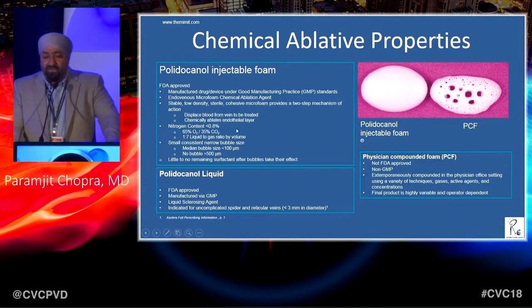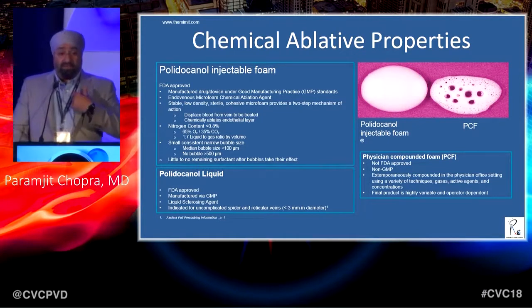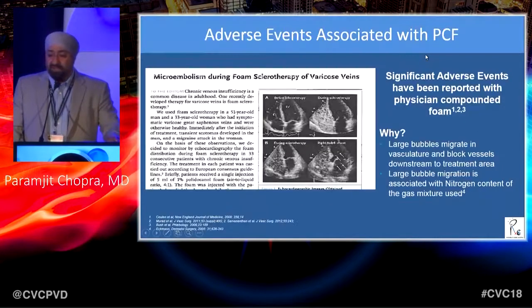You already have seen some of this and heard about this. The key concept here is, and I tell this to my patients as well, there has not been one case in several thousand, even in patients with the patent foramen ovale and looked with MR, that they've had any complications, which is important. And you need that one patient to have that complication where they come into your office, you're doing some foam therapy, and all of a sudden they got a TIA or they can't see partially. It just is not good for your practice. And I don't know whether that's a risk I really want to take. And some may want to do it.